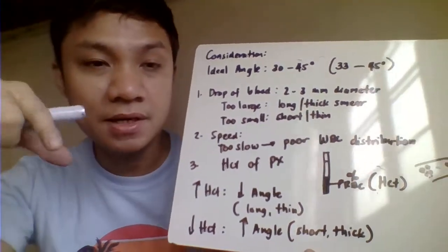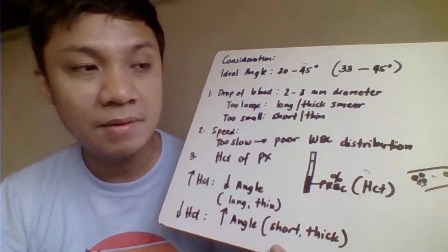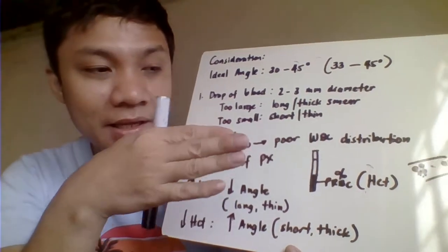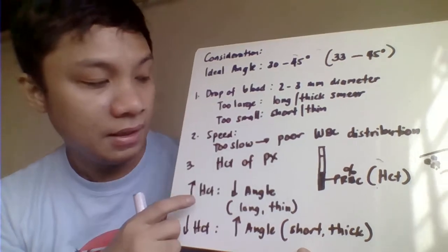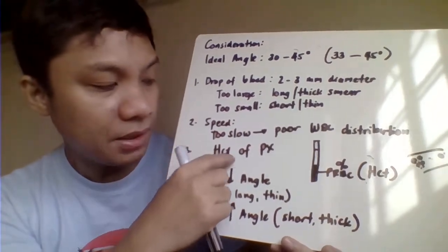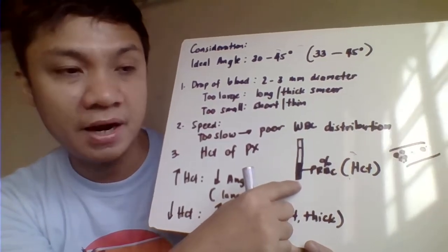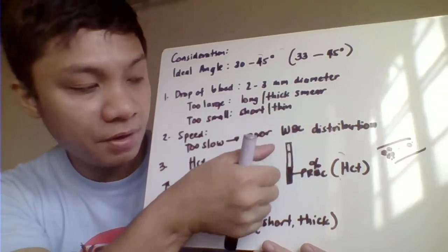That's why our blood film preparation should not be too slow or too fast. If it's too slow, the transition of our blood film will not be smooth. Another consideration would be the hematocrit of the patient. Hematocrit of the patient represents the percentage of your PRBC compared with the total volume of your blood.